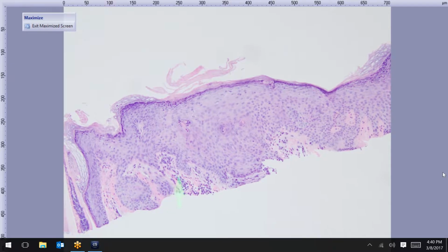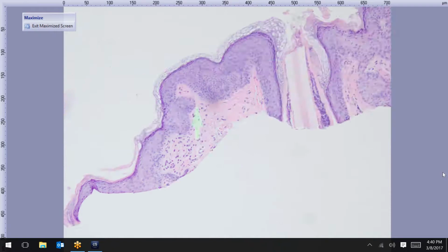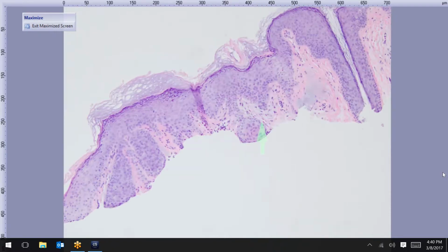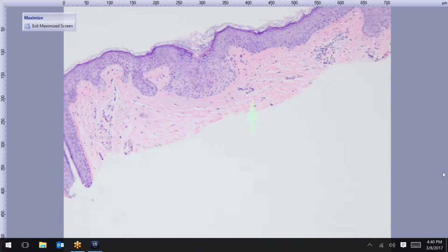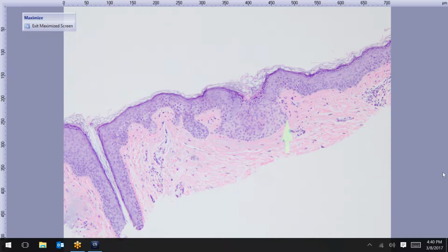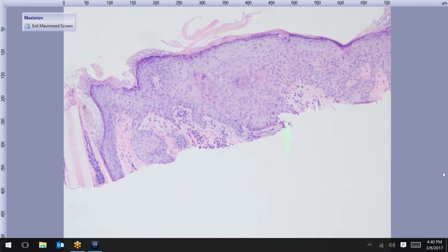And over here, you see these little projections emanating off. Even here you can get an edge of one right there. So it's pale projections coming off of the epidermis. Here's another, you can see this hyperplastic pale area. So this one's a little subtle, but the pathology is there. So this is actually a tumor of the follicular infundibulum.